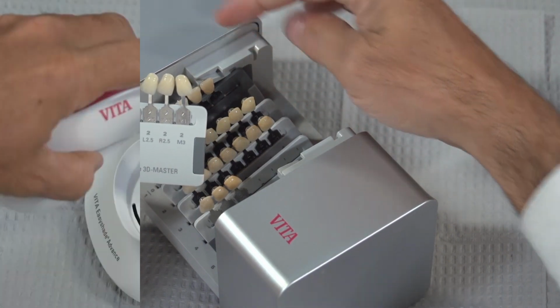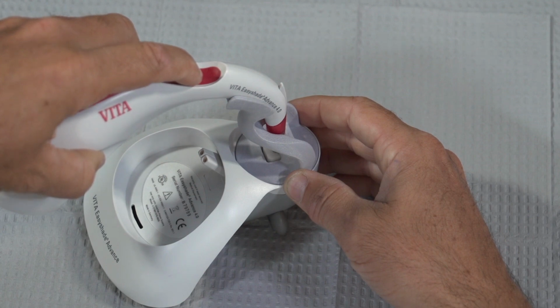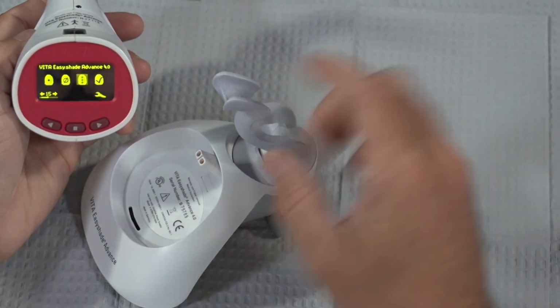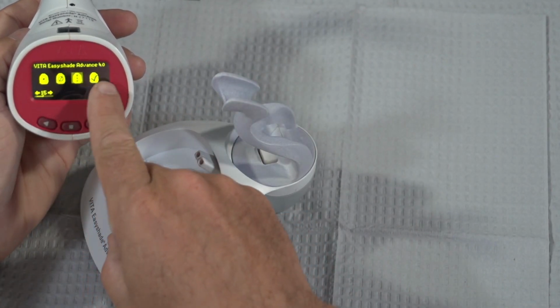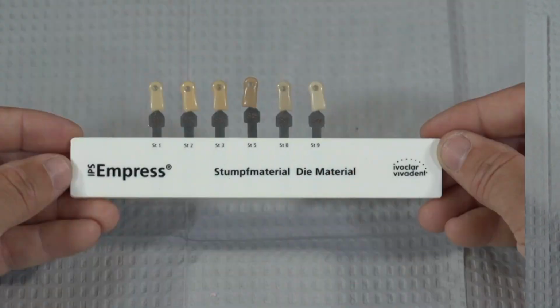Now, the Vita Easy Shade Advanced Digital Shade Guide takes much of the legwork out of shade taking by getting rid of the need for proper lighting in the operatory. Plus, it keeps results stored in its memory bank to be pulled up at a later time. Now, there is one more shade parameter that I haven't discussed yet. This, of course, is our prep shade.